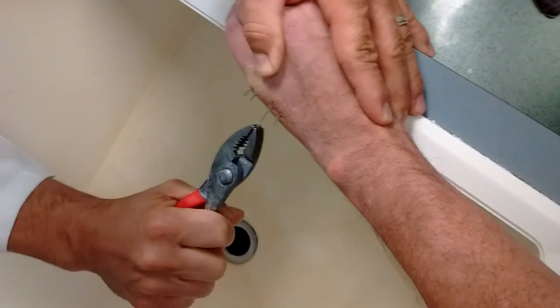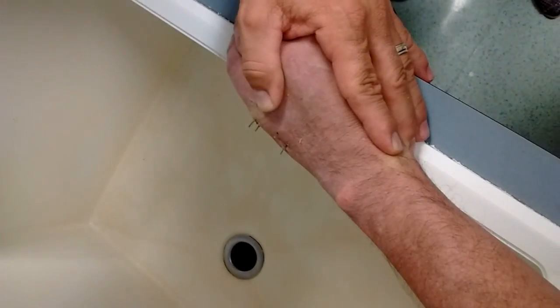And you can feel it give, and just kind of be patient with it. And it pops out. They all come out.